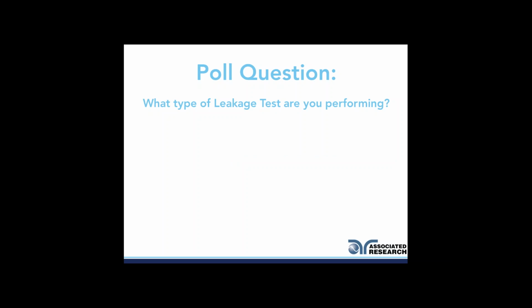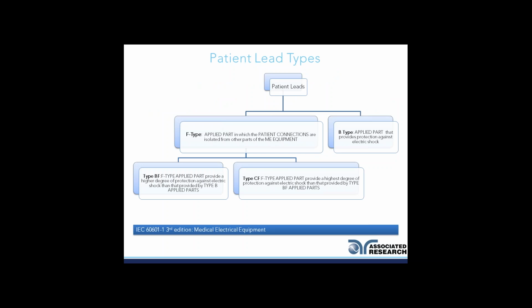Thanks everyone for voting. Let's move on to the next slide. We'll be discussing the different types of patient lead connections, and I'll go over the poll results when we get to that next section of this webinar.